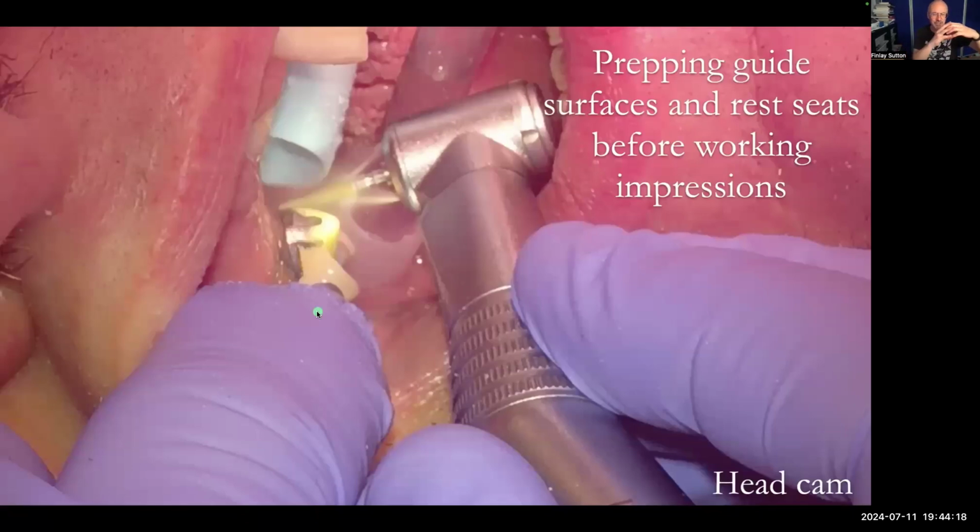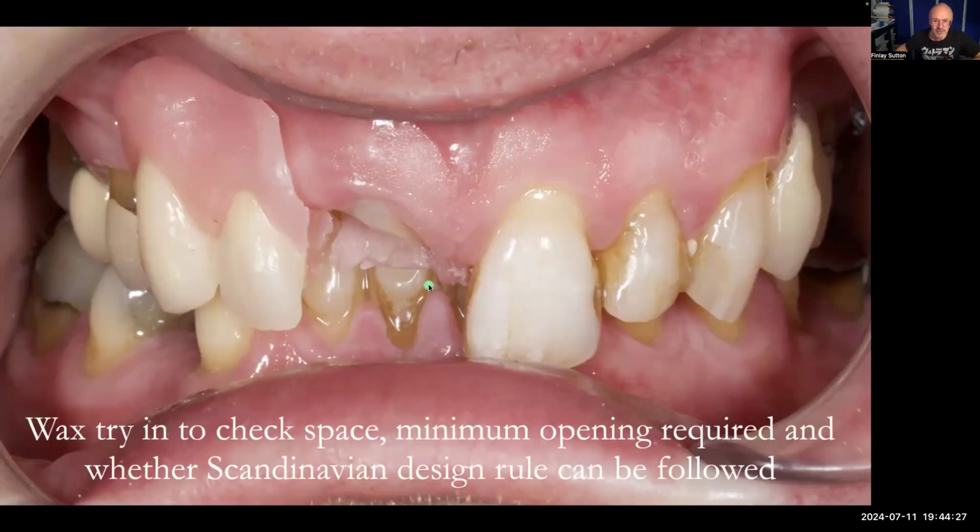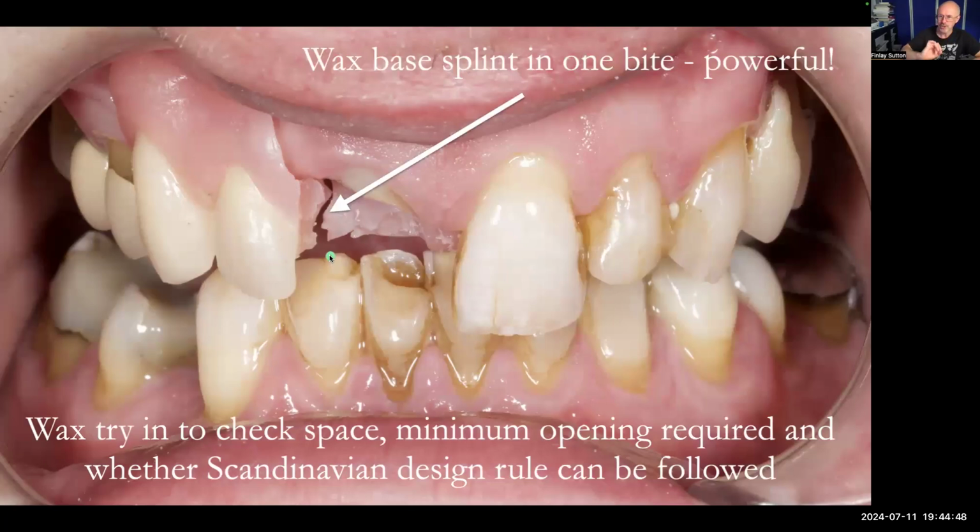What this does is it means that the metalwork can be thinner or not as bulky, because we've trimmed away a little bit of the tooth, and it doesn't weaken these crowns at all. So I've trimmed that tooth down. I've put my trying in, and he really does have an extremely heavy bite, does Brian? He's like a proper cruncher, and he split through that wax trying straight away. But this is purely a diagnostic thing for me, completely.